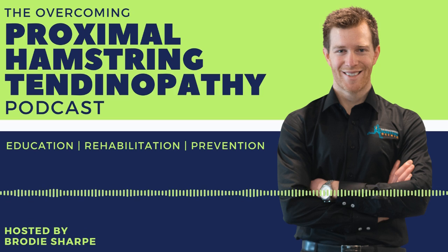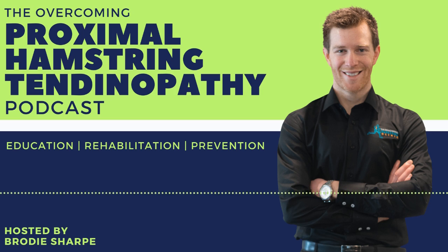People want to do an event 2 weeks or 1 week away, and they want to have a shockwave. Obviously, it might reduce your pain, but the tissue capacity is not improved. You can't improve a tendon in 1 week or 2 weeks, and you're just masking the symptoms and asking for trouble. So I've never given anyone Shockwave right before an event; you need at least 8 to 10 weeks before you can make a difference.